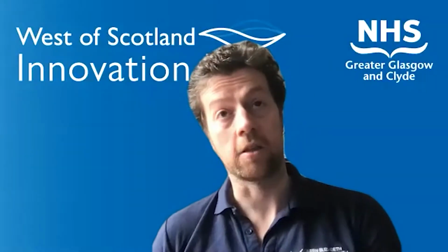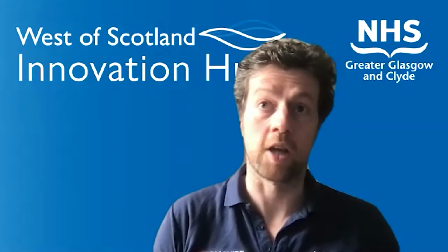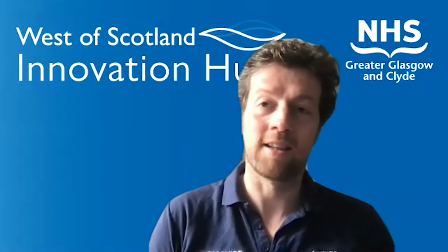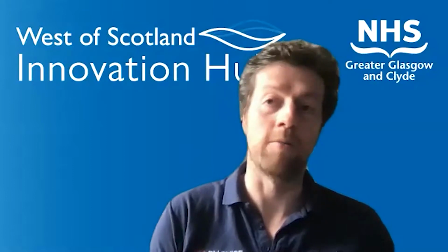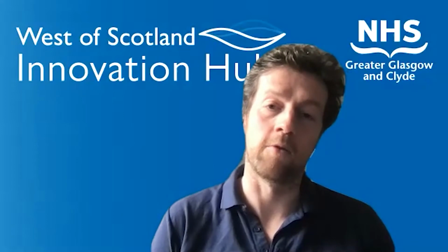I think that's a critical point, that actually it's not just about identification, it's also about prognostication. I mean, what care they're going to require, is it intensive care, and be able to plan for those, especially when those resources were more challenging to be available. That approach is really important because CT is what's been reported in some other countries, and especially in China, as their frontline investigation. That's clearly not something that we can maintain, and therefore chest x-ray as a kind of primary tool for investigation becomes actually the one we can embed within the clinical pathway moving forward.